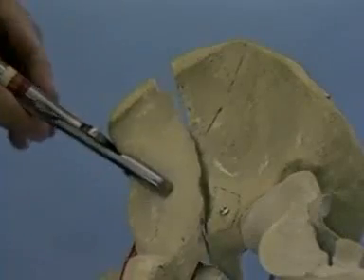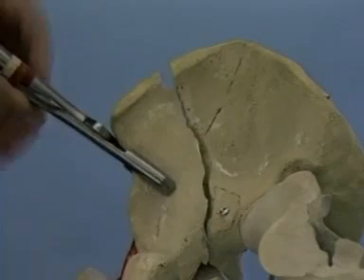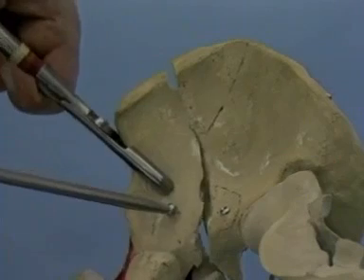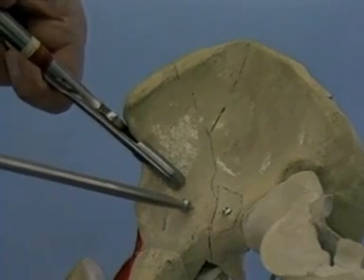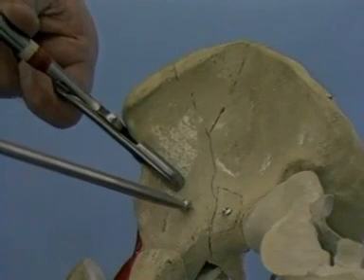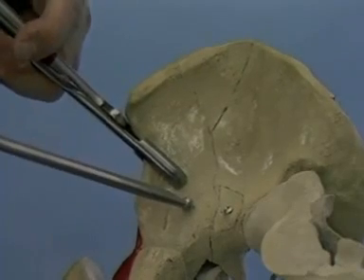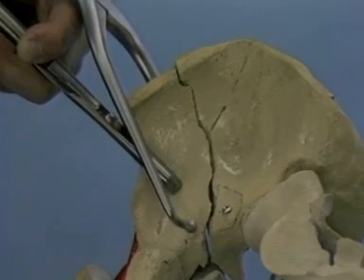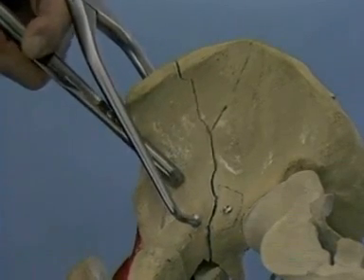The Farabeuf clamp is used to grasp the anterior border of the bone at the level of the anterior inferior iliac spine. This clamp will control the rotation of the anterior column. Pressure with the ball spike near the pelvic brim corrects the medial displacement of the anterior column. It is often helpful to place the king tongue on the inner and outer aspect of the bone to complete or hold the reduction.